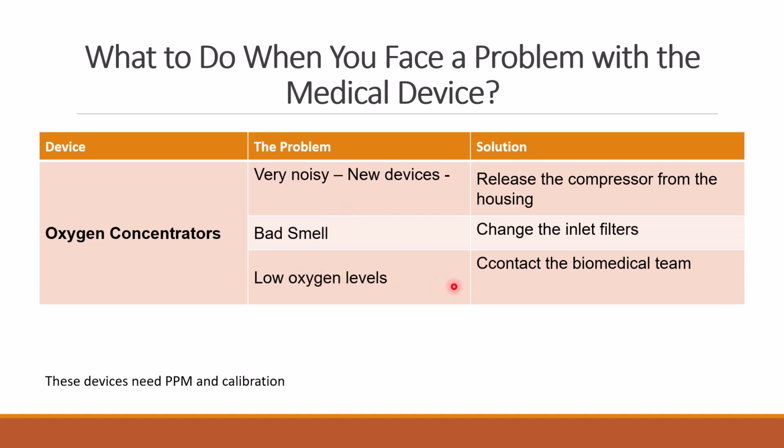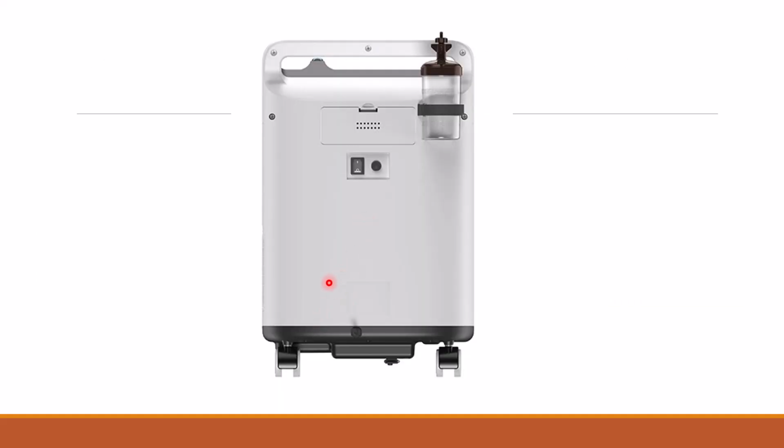Low oxygen level: you have to contact the biomedical team, because we need to open the device and change the molecular sieve inside the device just to obtain a concentration of oxygen between 90 to 95.